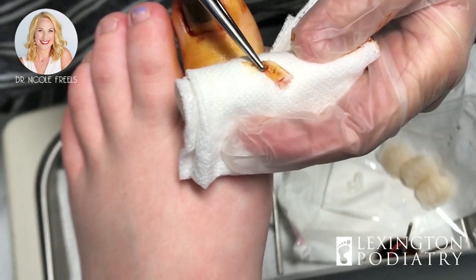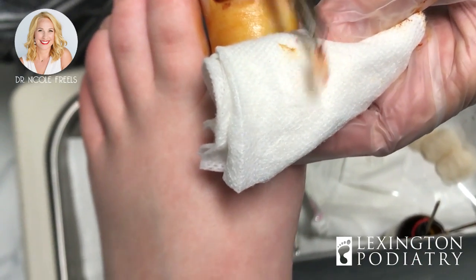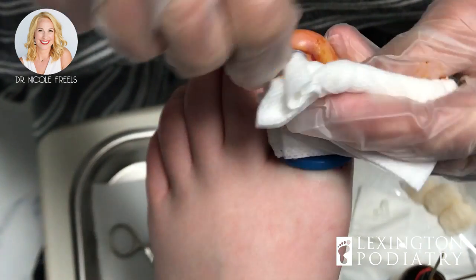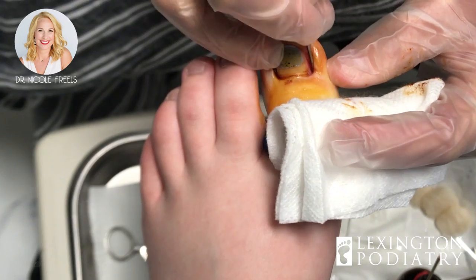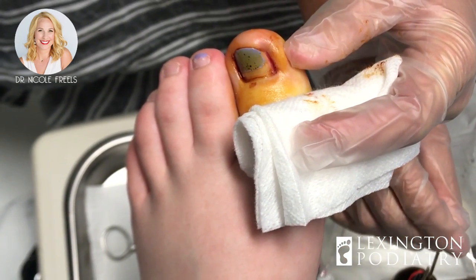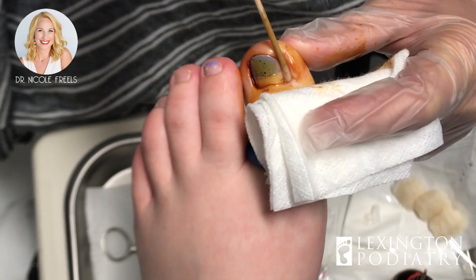There he is. Do you want to see it? No? Okay, don't worry. There it is, that's out. We just need to make sure there's nothing left in there. All right, you're done. I just need to put the medicine on so it doesn't come back.